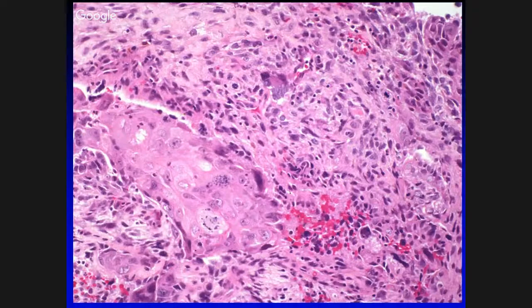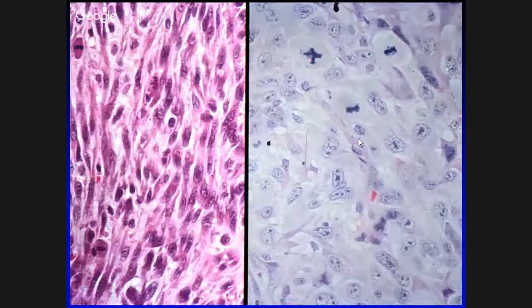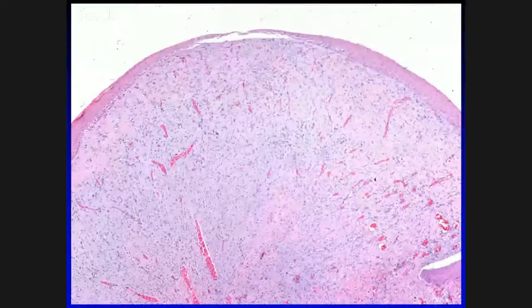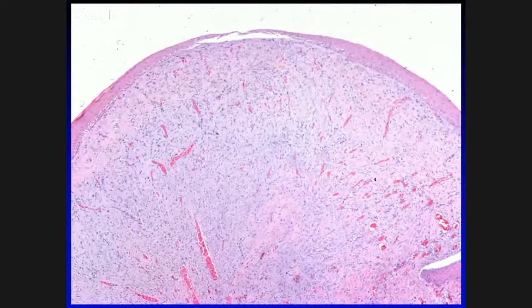So here's invasive squamous cancer and the spindle malignancy. That on the left is more spindled, on the right more epithelioid or pleomorphic. Mitoses, atypical mitoses are features that are often but not always seen.